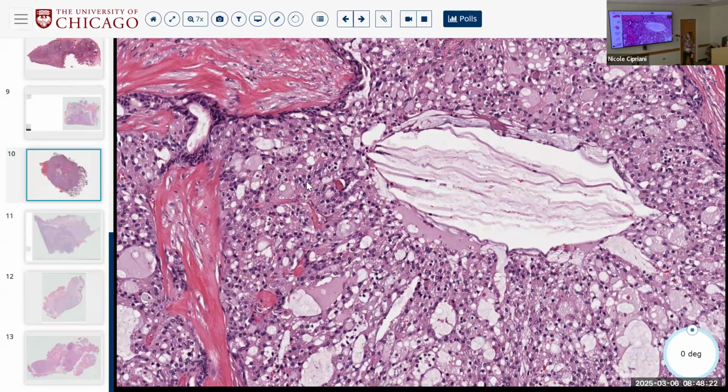P40 negative, because this does not have a biphasic phenotype and it's not of myoepithelial cell phenotype. C-KIT, maybe positive, but in a random distribution. You wouldn't see nice, perfect ducts in it. It probably is just going to be patchy and random.